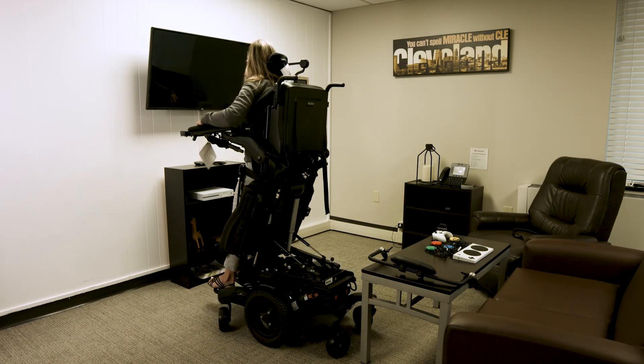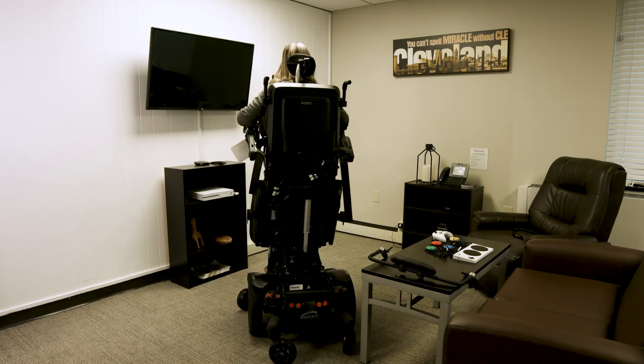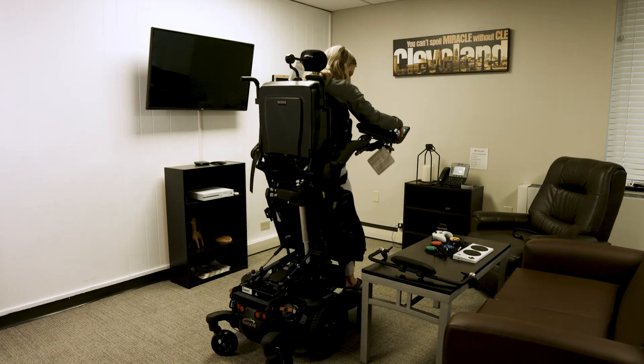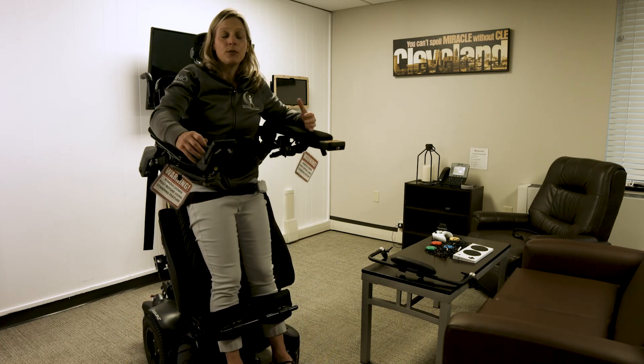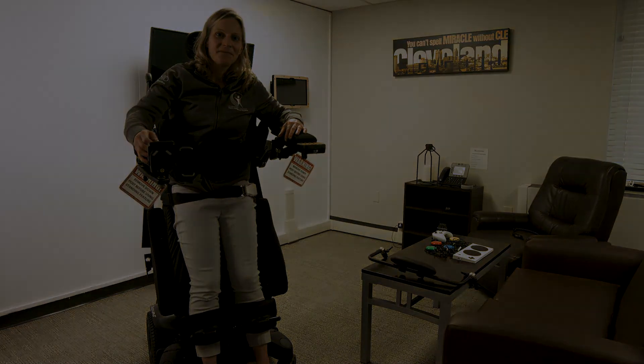The lower extremity elevate feature is really wonderful, especially if you have edema in your lower extremities, to help return fluid back to the body and reduce swelling. That supine position is also very comfortable. The next feature is the lift feature — in this setting you stay seated, but the wheelchair seat raises up. The amount of elevation varies from model to model but generally runs between four and ten inches.